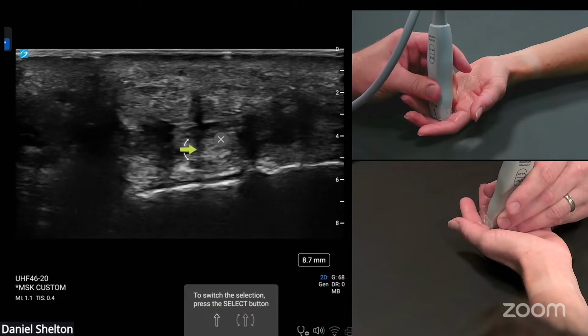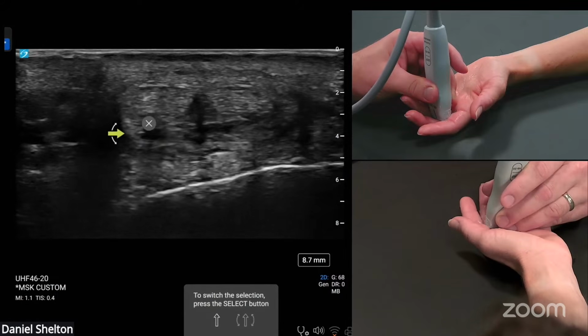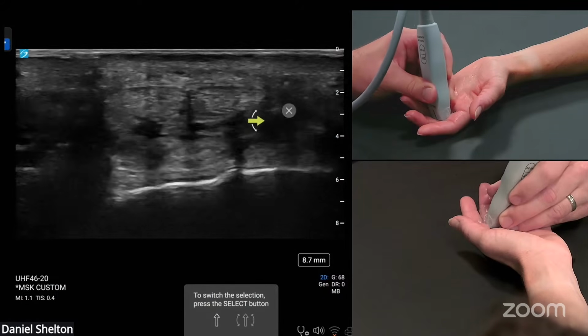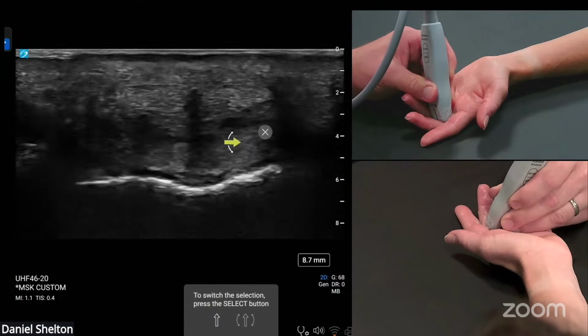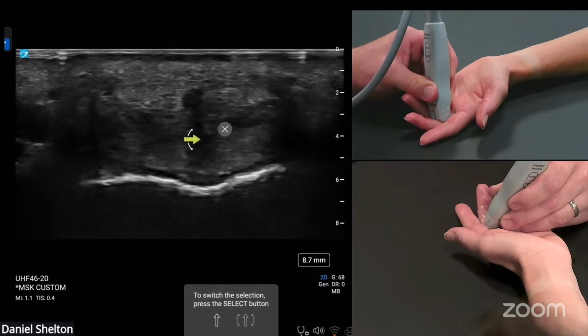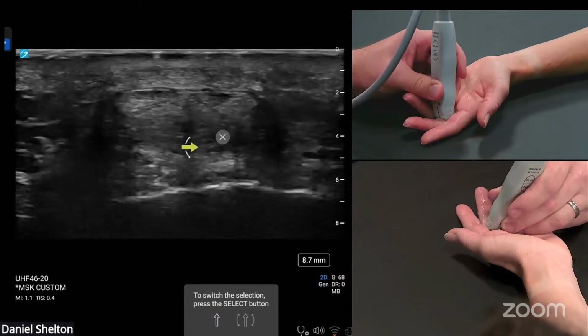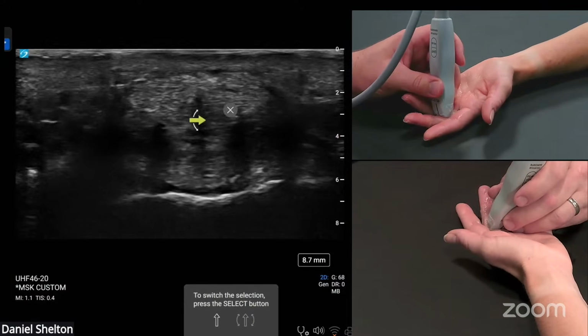So this is like a hammock bridging the gap between superficialis, and then there's this connective tissue, like the dorsal part of the hand at the DIP had that triangular ligament bridging that gap over the joint. We have a lot of that kind of similar architecture here, and that's where we see Camper's chiasma, and it does hold some arterial supply to the flexor tendons.